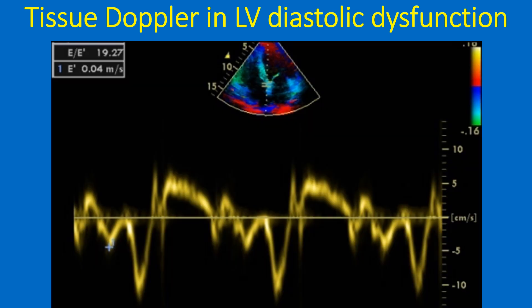The pulsed wave tissue Doppler tracing shows that the next negative wave after E prime occurs during atrial contraction and is designated AA. The positive wave after AA is the SA wave, representing the systolic myocardial wave recorded as the annulus descends toward the apex. E prime velocity is also known as EA (A for annulus) or EM (M for myocardial velocity). It reflects early myocardial relaxation and occurs during the ascent of the mitral annulus. Measurement of E prime is useful in differentiating pseudonormalization in mitral inflow from a normal pattern.